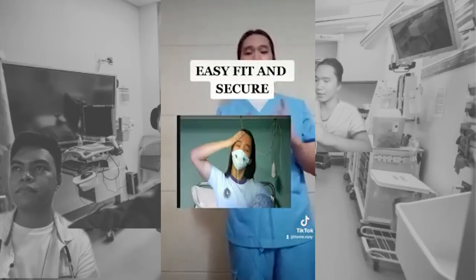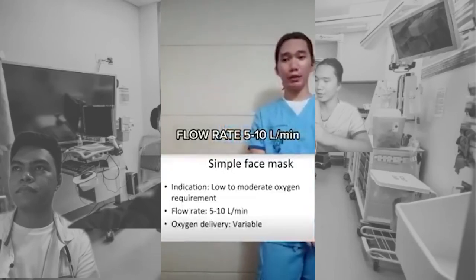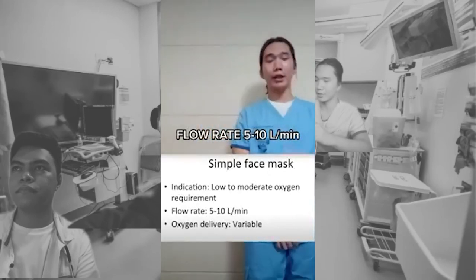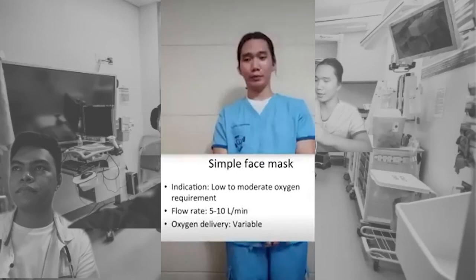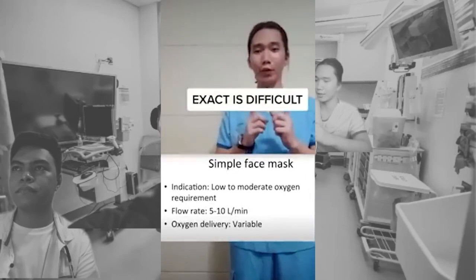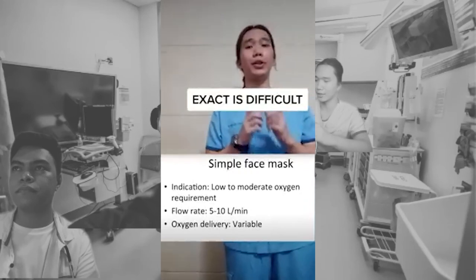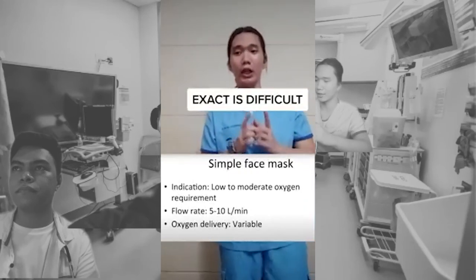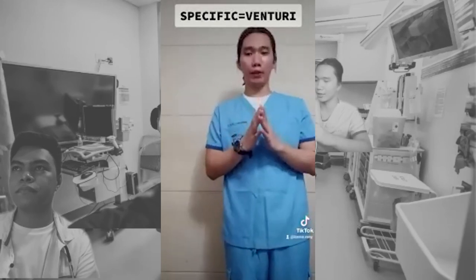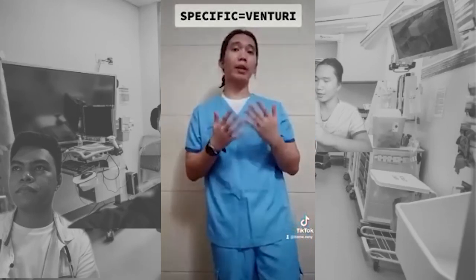behind the patient's head. The flow rate of a simple face mask should be adjusted to 5 to 10 liters per minute depending on target saturation. However, exact oxygen delivery is difficult to know when using a simple face mask. If a specific concentration is needed to be delivered, a Venturi mask might be a better option for the patient.